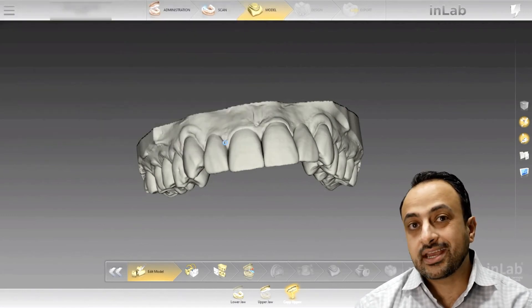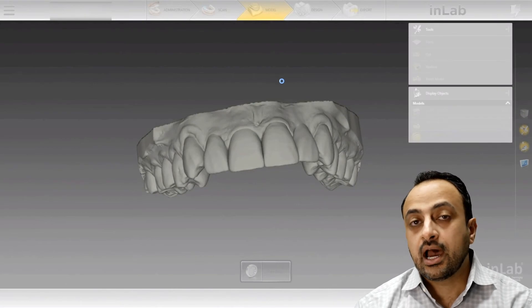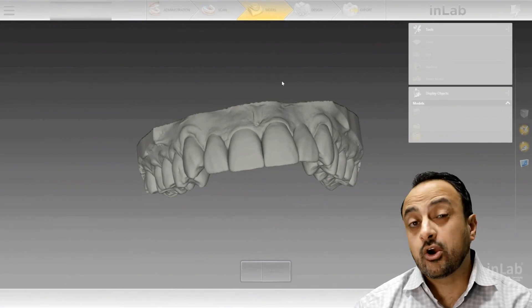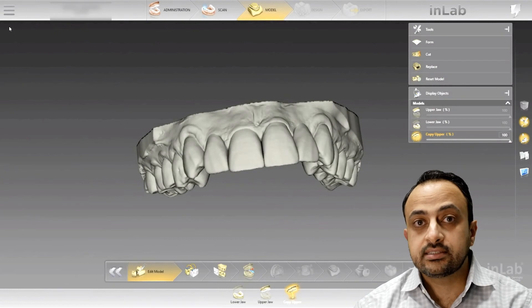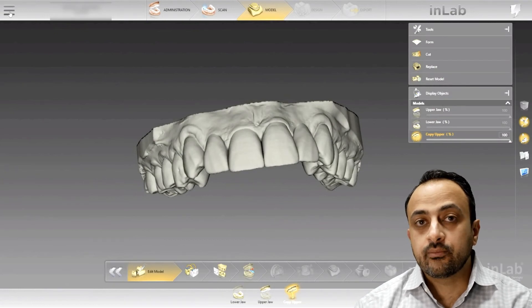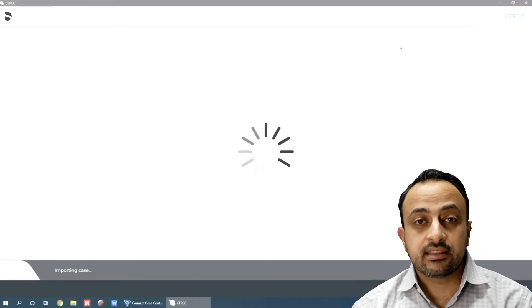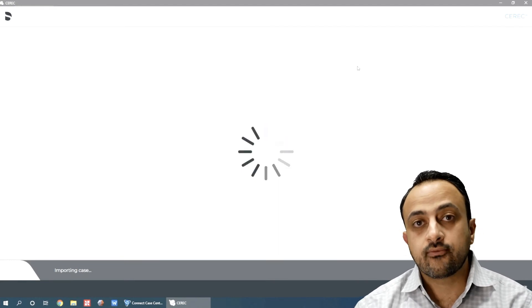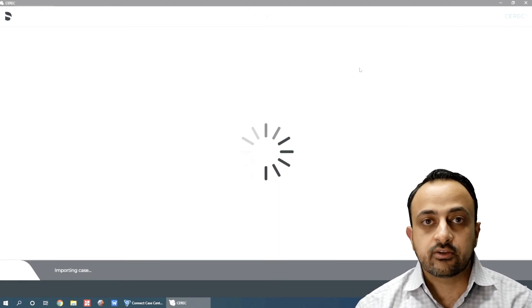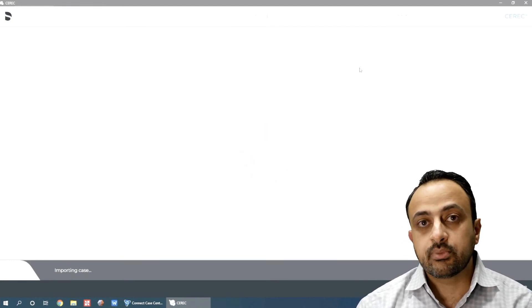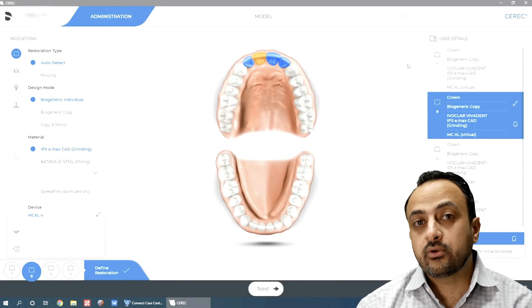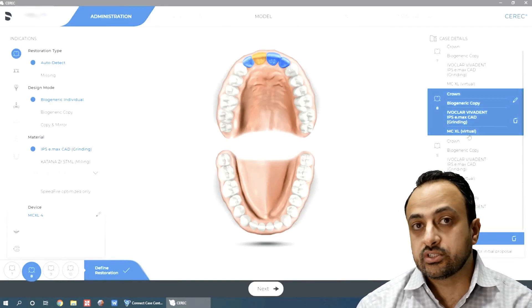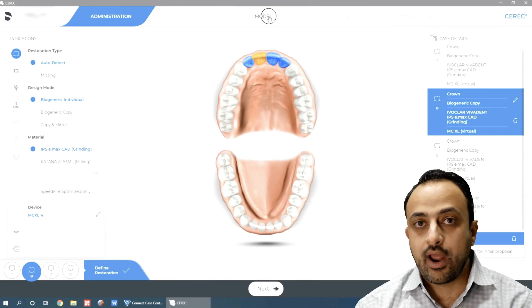Once I export the DXD to my desktop, I'll open up my CEREC Chairside software and go ahead and import that DXD. From there, I can go ahead and design the case fully in my typical Chairside software, marginate the teeth, and design the restorations using bio copy. However, the bio copy will be highly accurate and highly detailed because it was a true STL from the wax up.